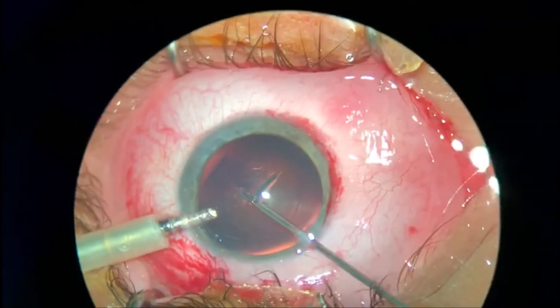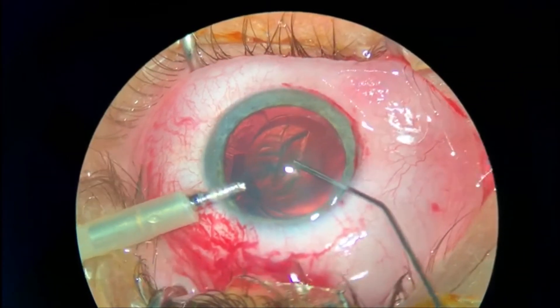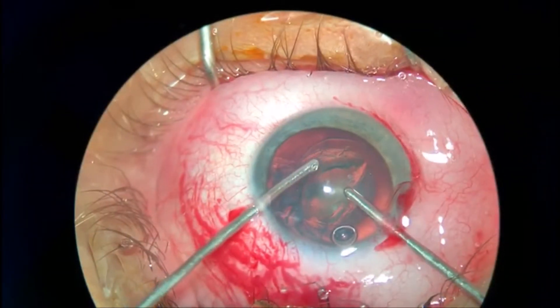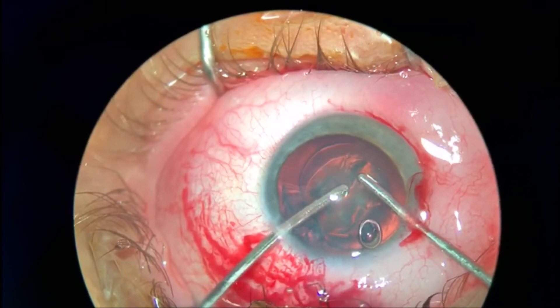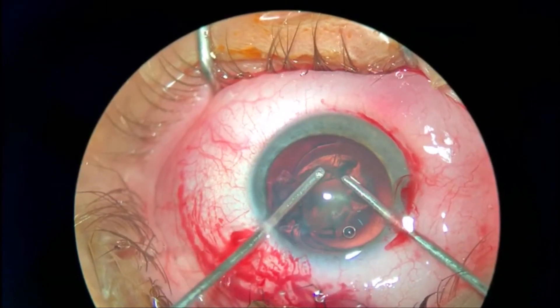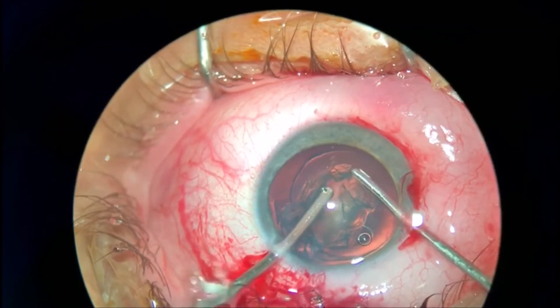The hydrodissection is also doing the hydrodelineation at the same time. I plan on using just the irrigation-aspiration to take out this cataract, since it is a very soft nucleus and epinucleus.